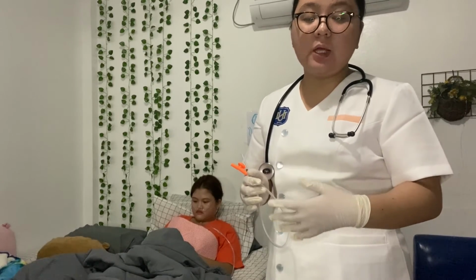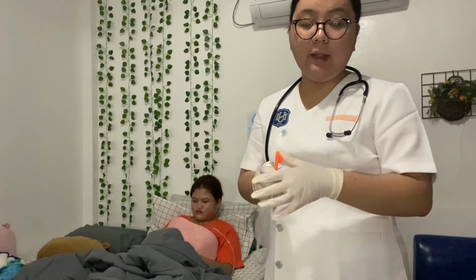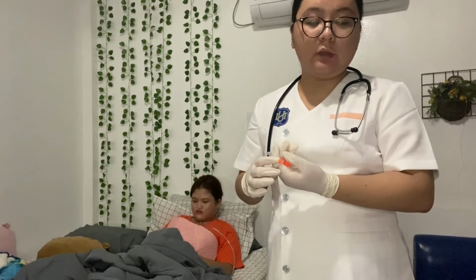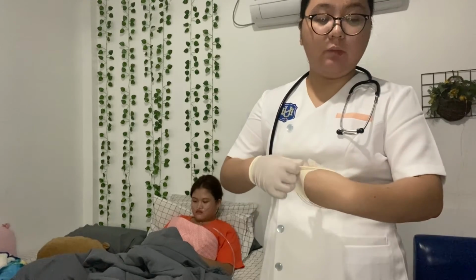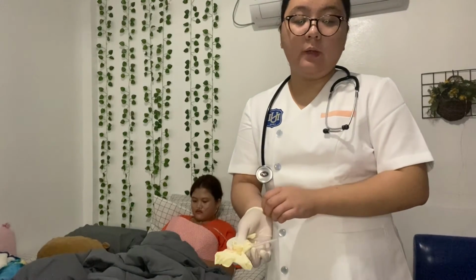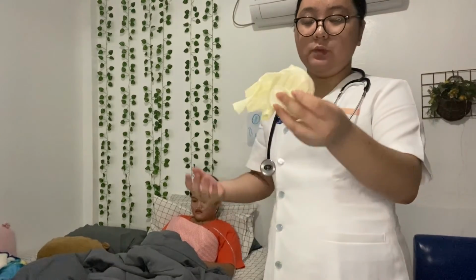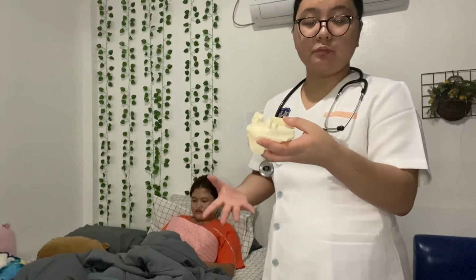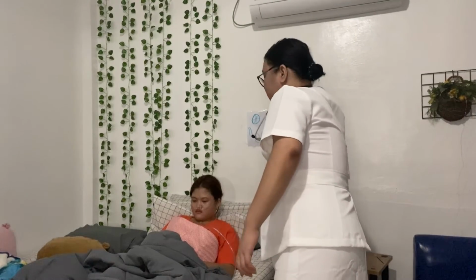And then when the suctioning is completed, roll the catheter around the finger of the dominant hand. Pull the glove off inside out so the catheter remains coiled in the glove, and pull off the other glove the same way. Discard in appropriate receptacle. Turn off the suction device, which is this one. I'm going to put this one into a proper waste. And I'm going to turn off the suction device.